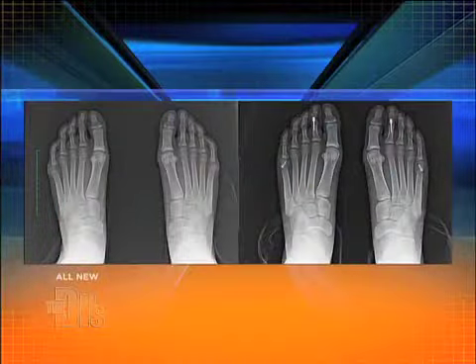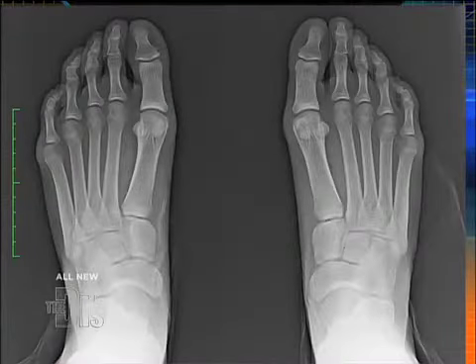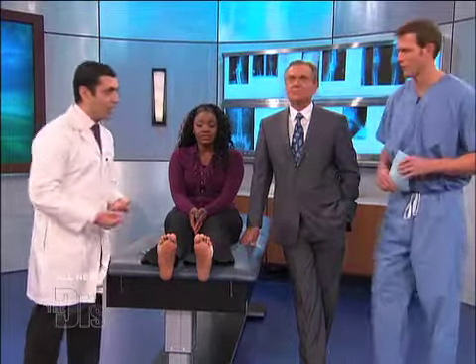And these x-rays will show actually what's happening with the bones of your foot. We have a before and after x-ray here. Talk to us about what we're seeing. So if you take a look at this pre-op x-ray, what you can see is she has a tailor's bunion on the outside. Those bones flare out on the outside, causing that bump, which she's young right now, but those can become significant as she ages and cause a callus, which is irreparable. So the bunions we're talking about over in this area, on both sides. Exactly. Yes. So that narrows the foot and gives her some relief from wearing shoes.